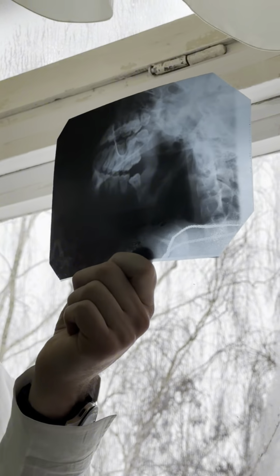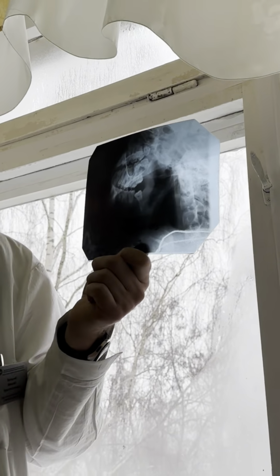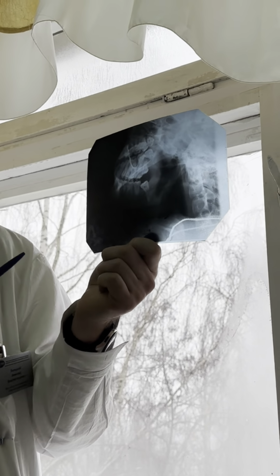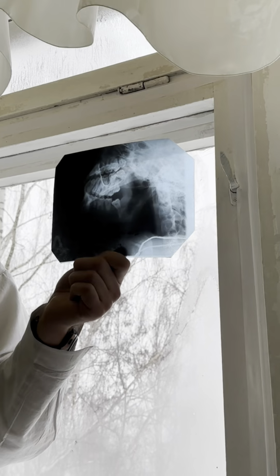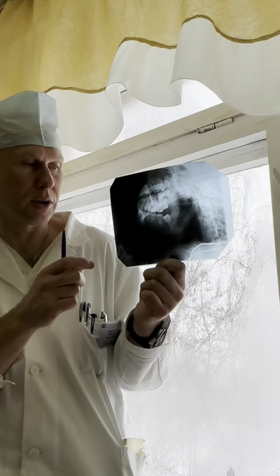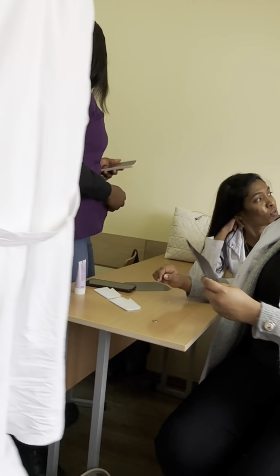Did you understand? First of all, describe, after that, diagnose. Traumatic angulus fracture of the mandible, full open fracture of the mandible, left side. This is a full diagnosis using X-ray picture and clinical symptoms of the fracture. Try to describe your pictures.